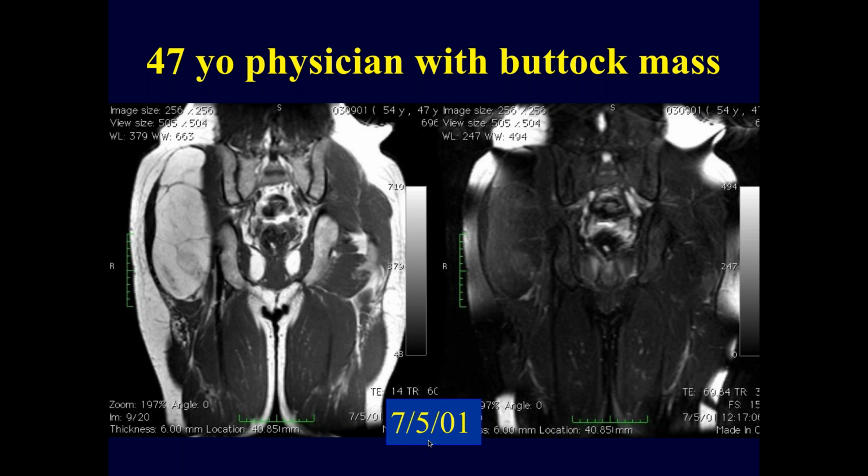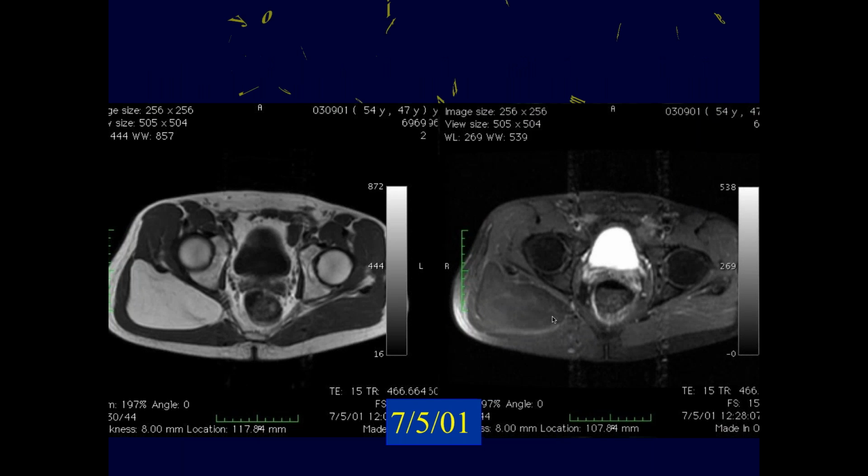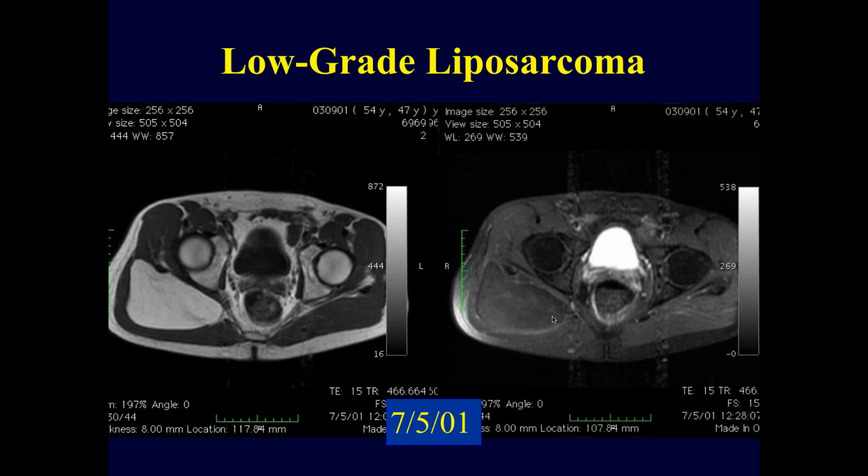So this was on 751, and here are the axial images. Okay, so more of the same. So you can actually see that there's inhomogeneous fat suppression on the fat suppressed images. Okay, so this patient then went on to biopsy, and this was a low-grade liposarcoma.